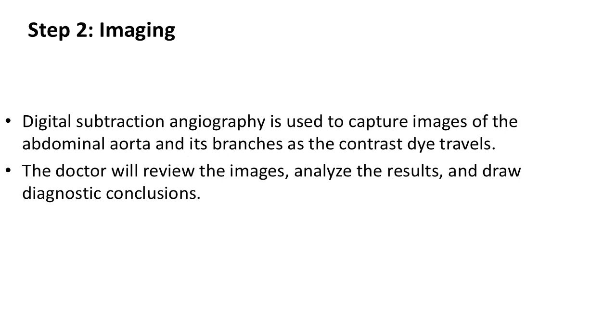Digital subtraction angiography is used to capture images of the abdominal aorta and its branches as the contrast dye travels. The doctor will review the images, analyze the results, and draw diagnostic conclusions.